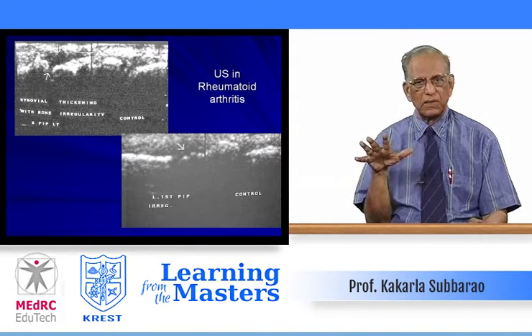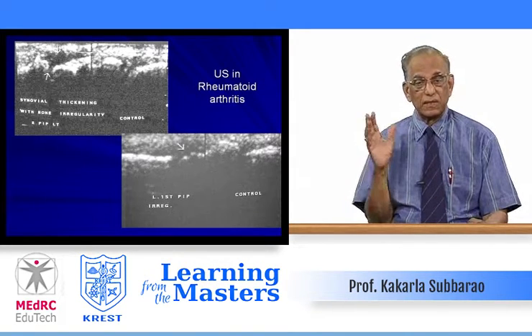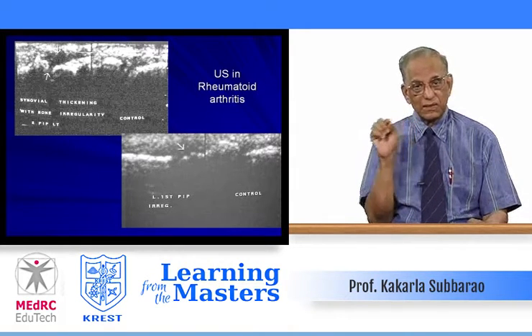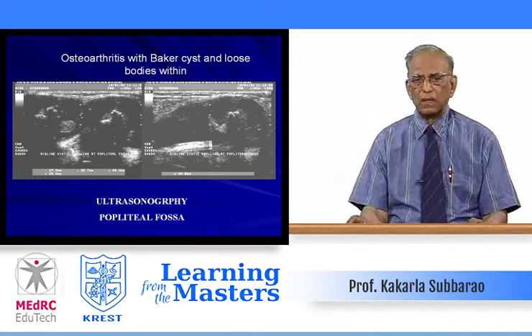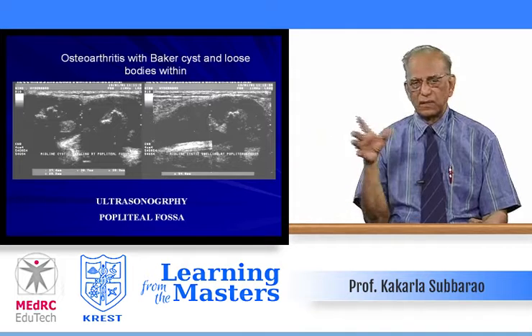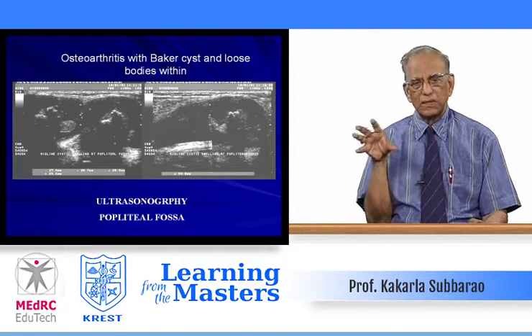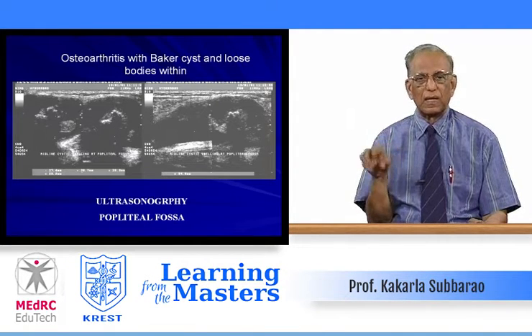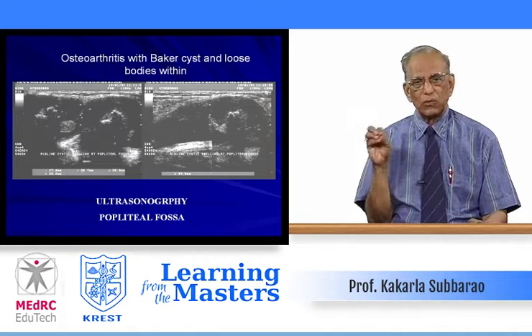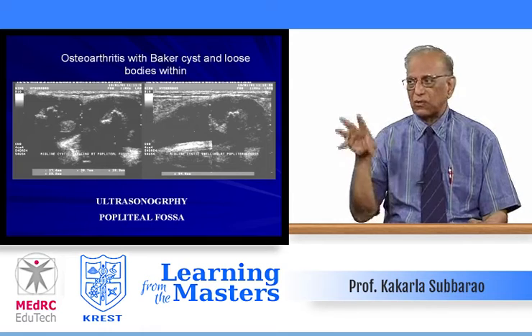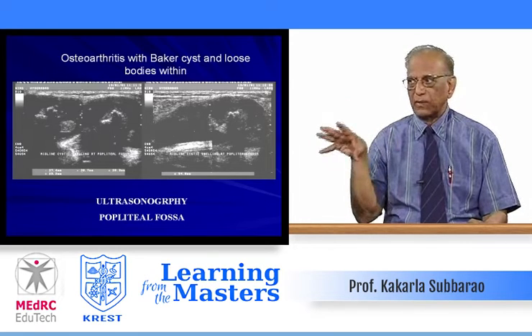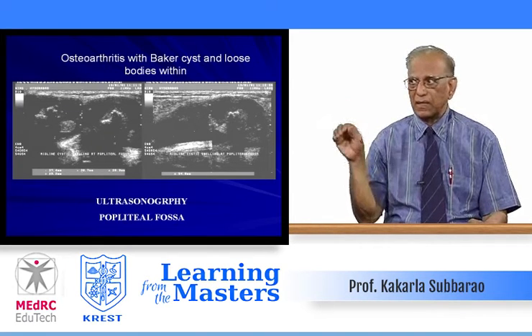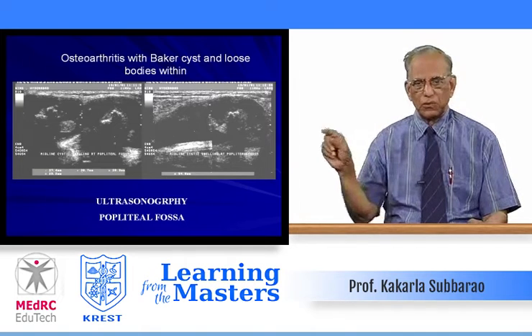Another case shows osteoarthritis with Baker's cysts and loose bodies within. The principle is that the cyst is anechoic or hypoechoic, whereas loose bodies — whether chondral or osteochondral — are echogenic. That is how you differentiate a Baker's cyst with multiple loose bodies within.